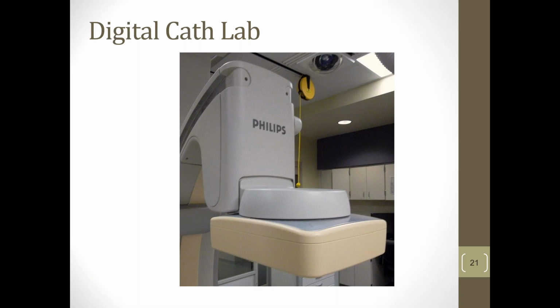One thing about the image intensifier, a lot of the radiologists and cardiologists liked the image that the image intensifiers gave, because it gave an analog image versus the digital images. Now everyone's switched over to digital, so you'll almost rarely see them. It depends on the radiologist's age too. Well, yeah, and I do agree with them.